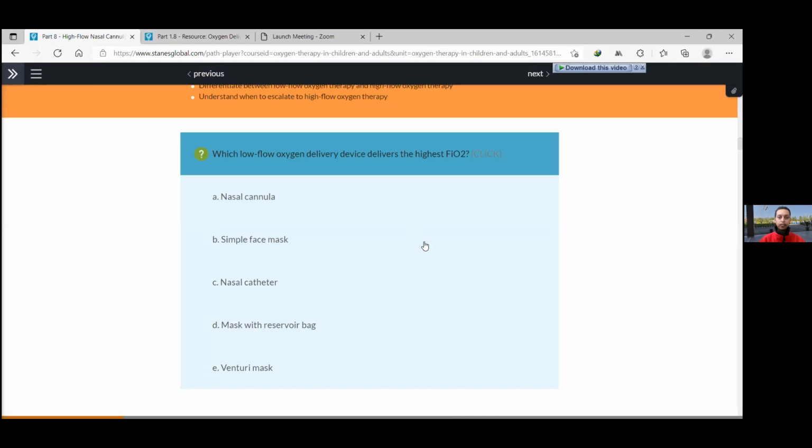Yeah, I think Dr. Isaac, it was a very nice detailed description of the different oxygen delivery devices. So many of our participants, I think, chose Venturi mask because it's maybe newly arriving in Ethiopia, and it's a new term, and they may think that it can administer a higher fraction of inspired oxygen. But the reality is mask with a reservoir bag, because it has a reservoir. So the next time the patient breathes, the patient breathes from the reservoir volume, which is nearly 100% oxygen.